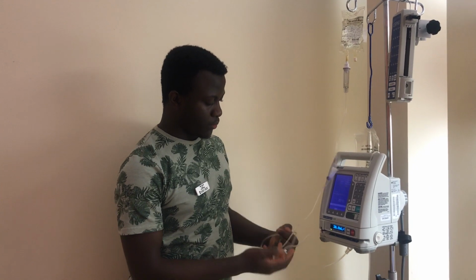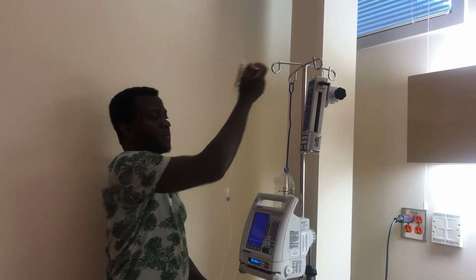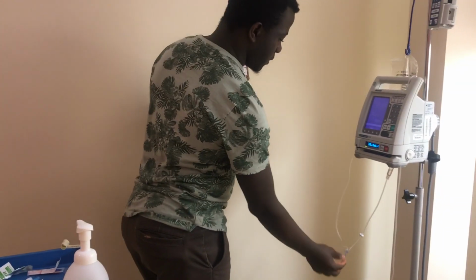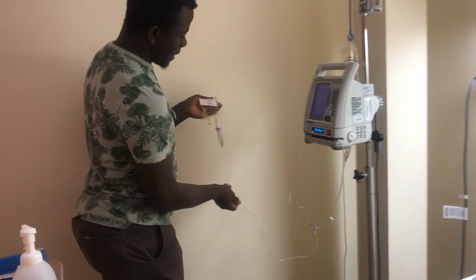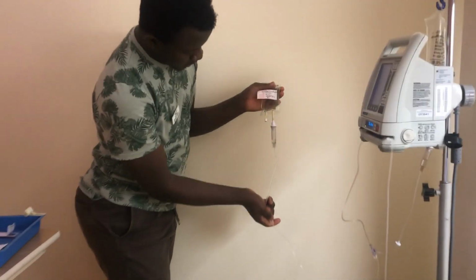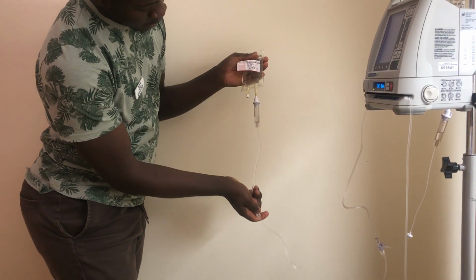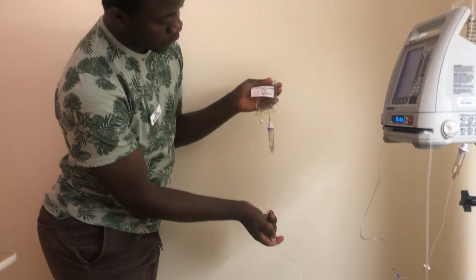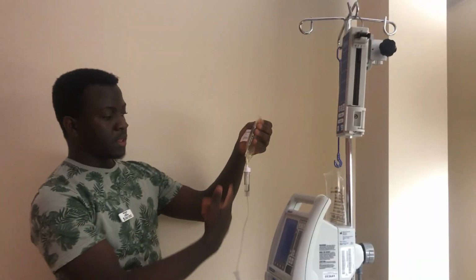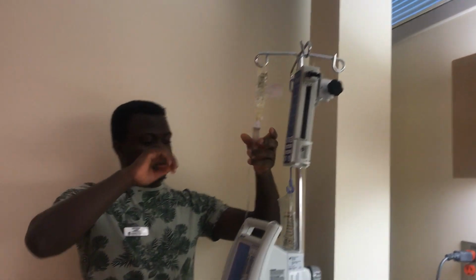Okay, so once my port is connected, I will bring down my secondary bag, which is the medication I'm administering, and gently open my clamp to back prime, so I don't lose any medication. So gently open my clamp, back prime till I have about 1/3 to half of the fluid in the chamber, and then I'll close my clamp, and doing that makes sure that I get rid of all the air bubbles and that my tube is completely primed.